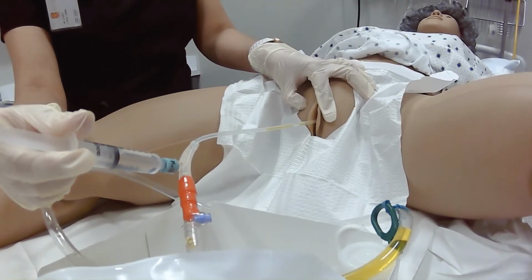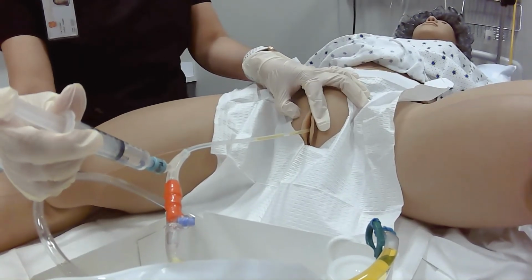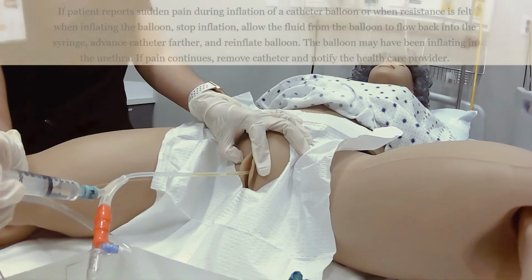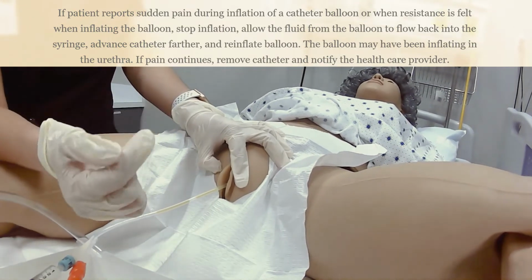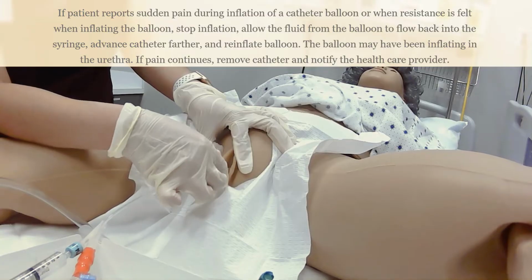So Miss Adams, is there any pain or discomfort? No. Let me know if you do, okay? If you feel anything. Thank you. Okay, yes. Okay, so if that happens, it could be that we're still not in the bladder. So what you can do is insert another inch, okay?